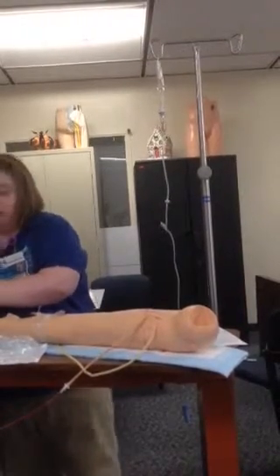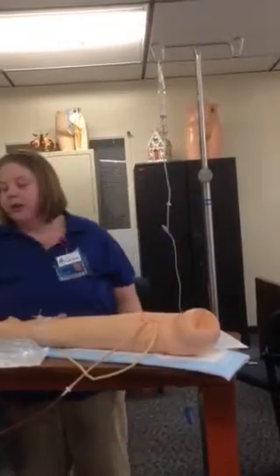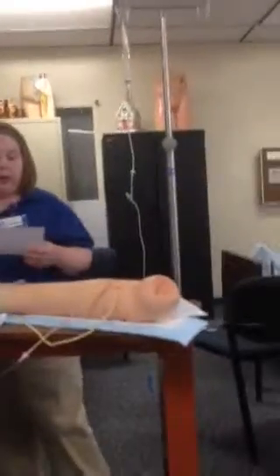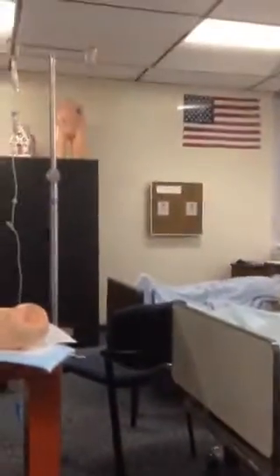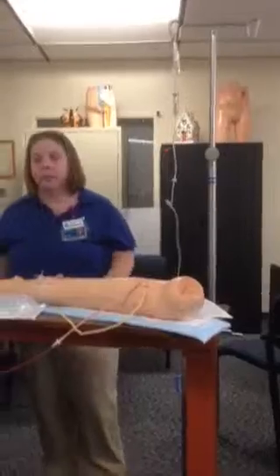Now I will double check for any type of reaction, check my 4 Ps. I will document the time, date, dose, and drug, the route, the site condition. This is my documentation card. I will dispose of all my needles and syringes. I would have disposed of all my needles and syringes before I documented. And that's all.